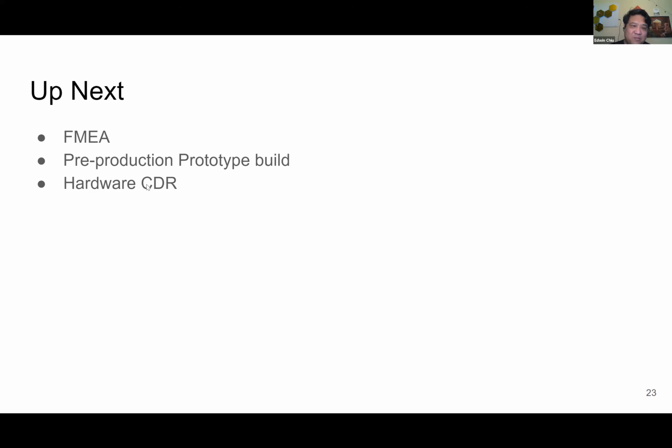So this is sort of like the big brother to the preliminary design review. This is where we've actually built the prototype, tested it as a fully built prototype, and collected data on it. We'll be stepping through each of the hardware requirements and demonstrating through the data that we have met them. That will be the gate to manufacturing. So we should do the CDR when we're almost ready for manufacturing. We want to prove to ourselves that we have built the thing that we intended to build and that it's going to work on a patient and be effective.